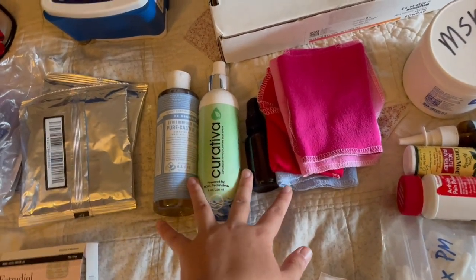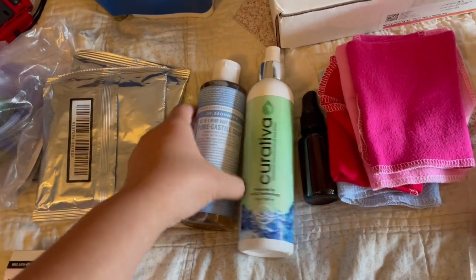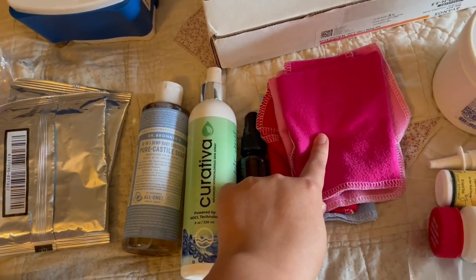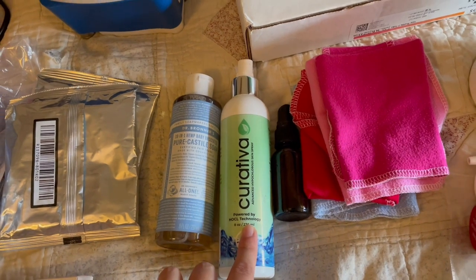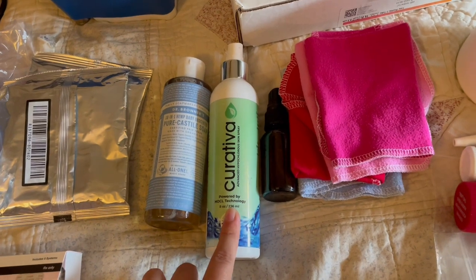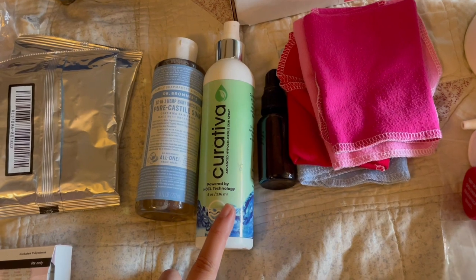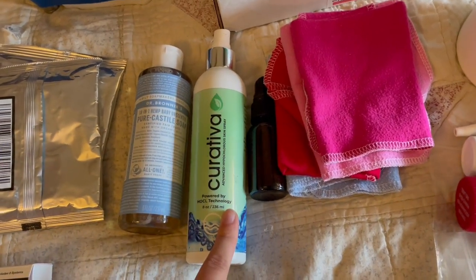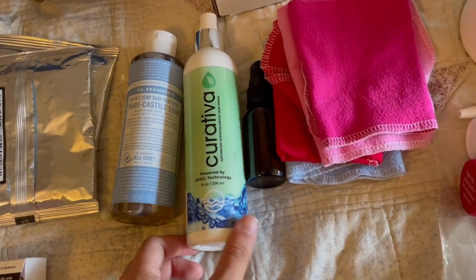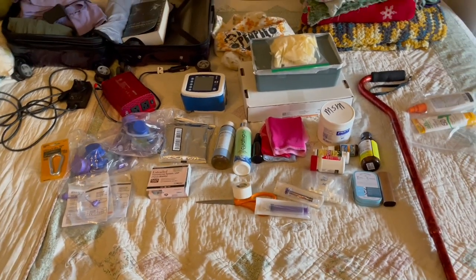This is how I keep my feeding tube clean in the forest: I bring a two-gallon water jug that has a spout on the end, so I'm able to wash my hands with it and then use it to clean around my tube and wipe around it with these washcloths. Then I use this spray for after I go swimming to clean around my tube, because I swim a lot when I camp so I like to keep it clean. It's usually used as a face spray to help with mask acne and stuff, but it works well for my tube — I've personally had a good experience using it.